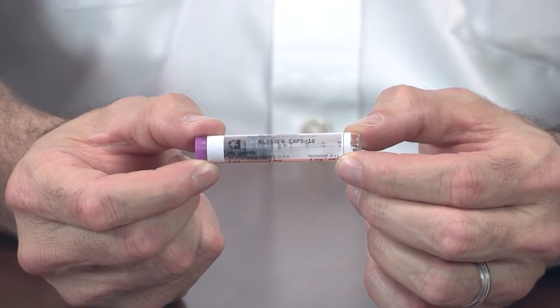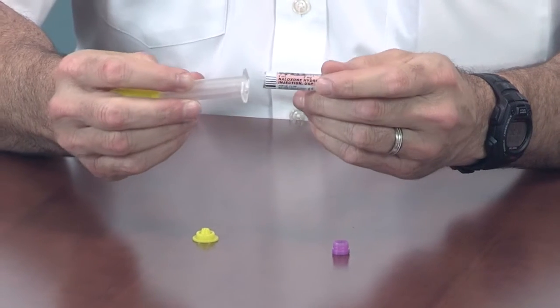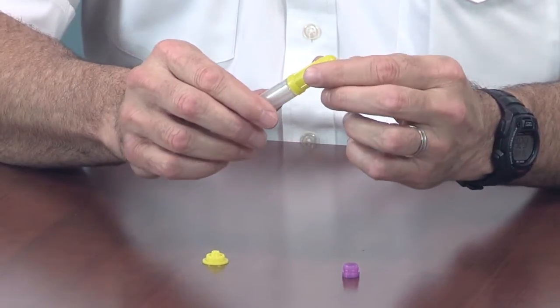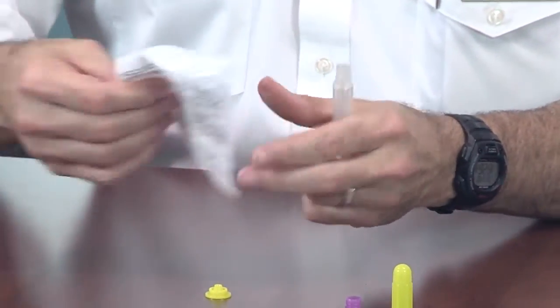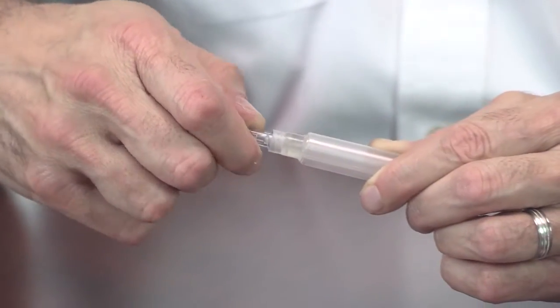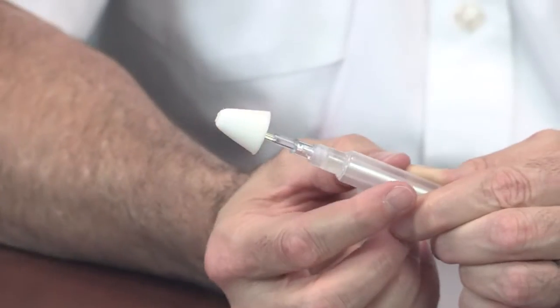To assemble these two pieces, you simply remove the purple and yellow small caps and insert the glass vial into the plastic syringe and twist until it's snug. Then you take the large yellow cap off and take your MAD device and attach it to the tip of the syringe in a twisting fashion until it's snug. Then your device is ready to be used.